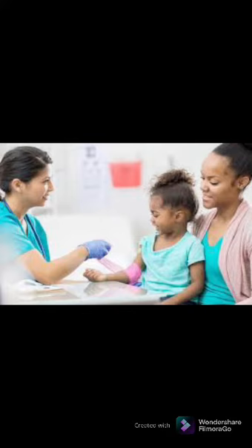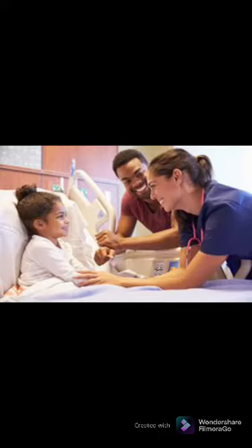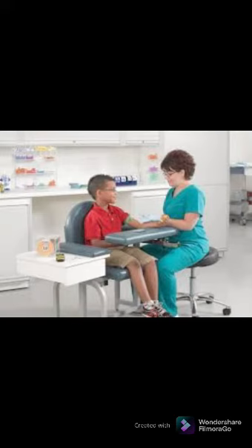Be honest with the child and never tell them that what you're about to do won't hurt. Explain to them that it might feel like an ant bite or an insect bite. Then you would ask the patient, parent, or guardian to hold them down or just to give them a gentle hug so that you may be able to perform the venipuncture.